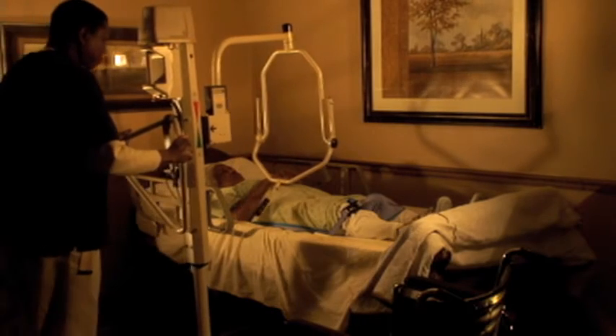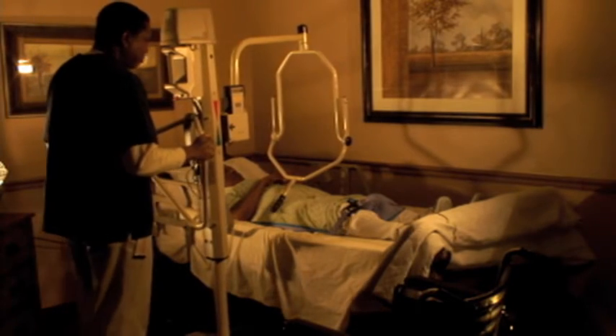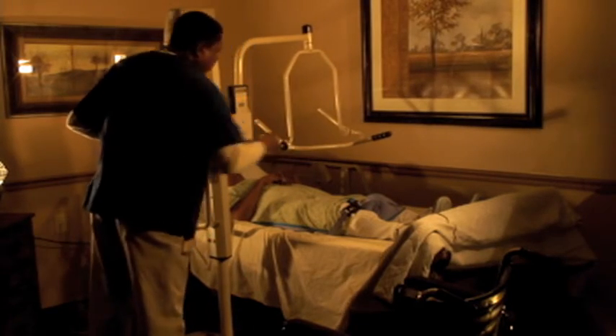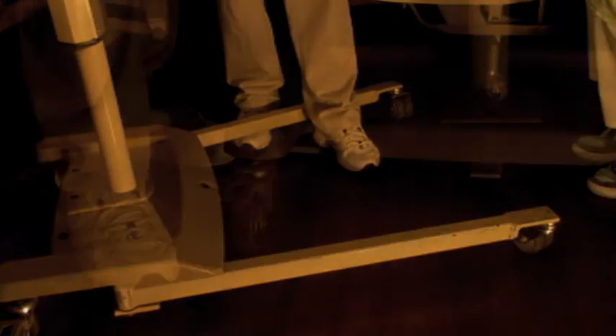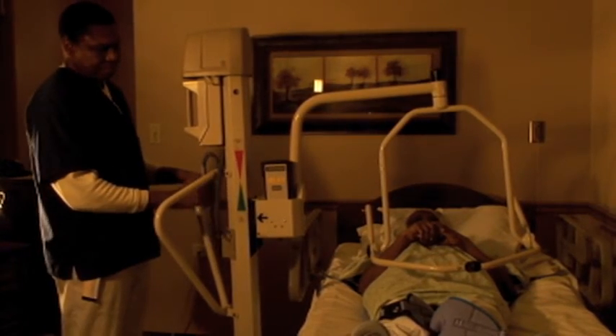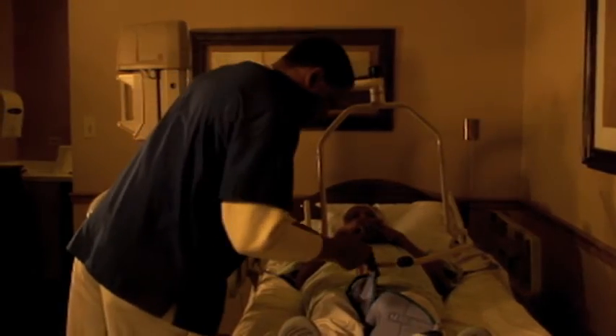Second, unlock the wheels of the full body lift by stepping on the foot brakes and move it into position, either in front or to the side of the resident. Third, widen the legs of the full body lift manually or by using the shift handle located in the back. Next, apply the wheel lock so it does not move once the full body lift is in position. Lower the lift boom to just above the resident where the sling loops are easy to reach by pressing the button located on the control box.